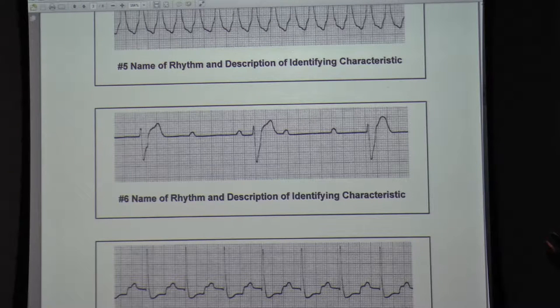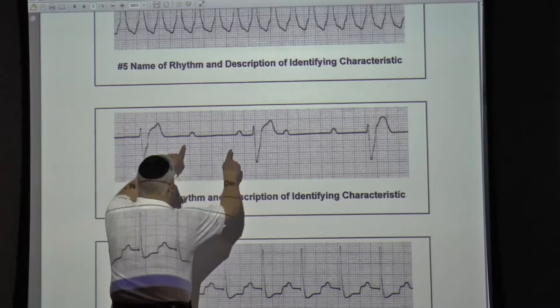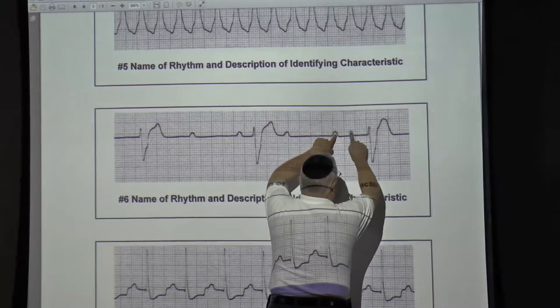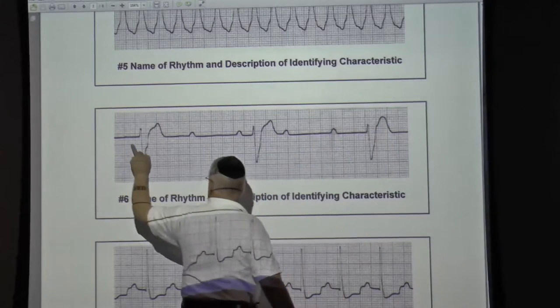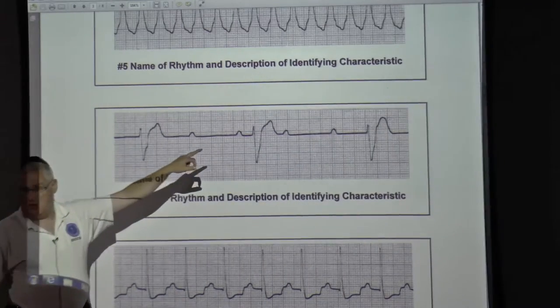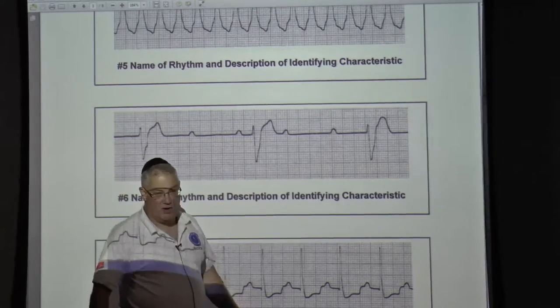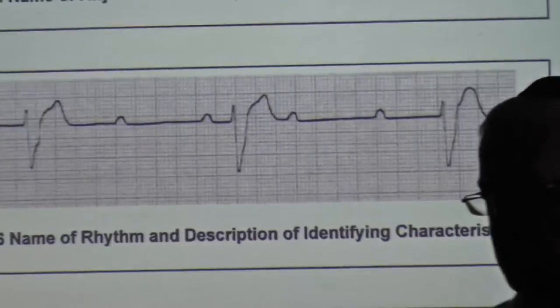Why does the patient not die? Because we have those backup pacemakers. So what does the ventricle start to do? Fire slow, 20 to 40. So if you were to actually be able to map this out, the distance from here to here would be the distance from here to here, the distance from here to here, okay? So one P wave is probably hidden in this QRS, which means the atrium is firing regularly. And if you mapped out the R to Rs, they're firing out regularly. So the atrium's firing perfectly, assuming that all its complexes are getting down to the ventricles, none are.